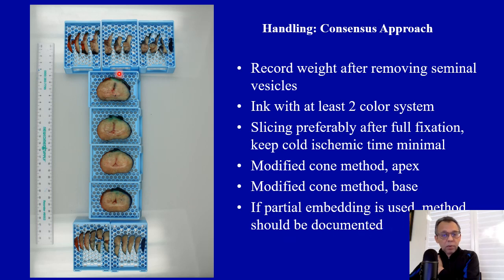Here is an example of an entirely submitted prostate using a whole mount methodology. In our lab, we amputate the bladder base portion with the seminal vesicle. So all the base sections also include the seminal vesicle stump. And then I will talk about that as well later on.